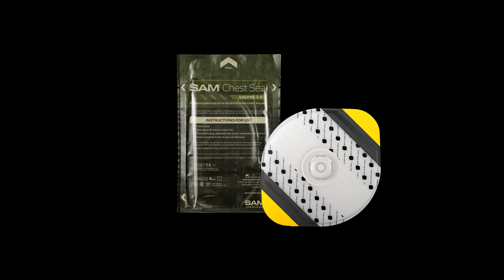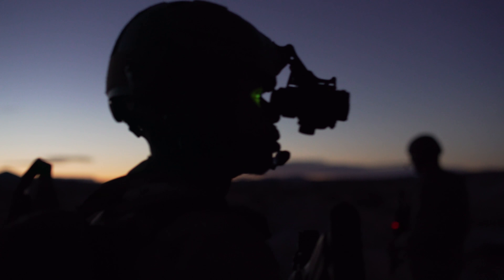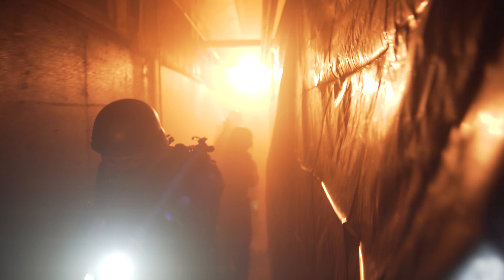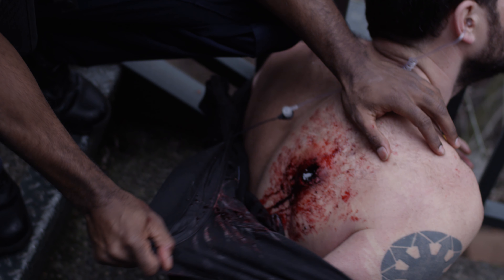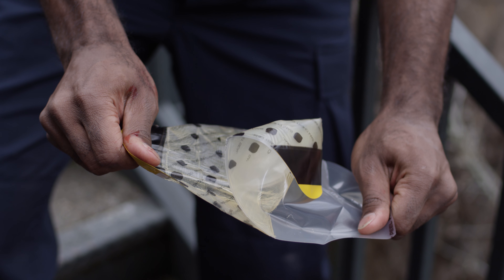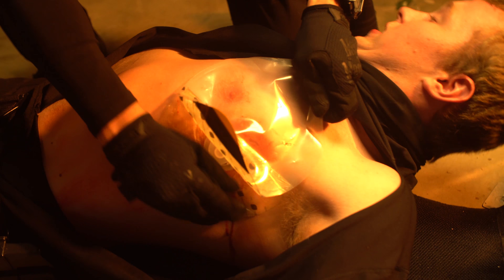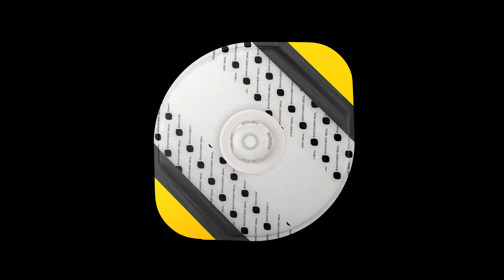This is SAM Chest Seal Valved 2.0 by SAM Medical. SAM Chest Seal Valved 2.0 includes one valved SAM Chest Seal.